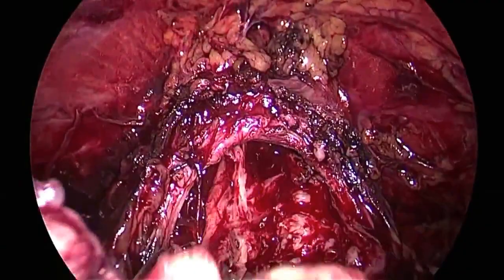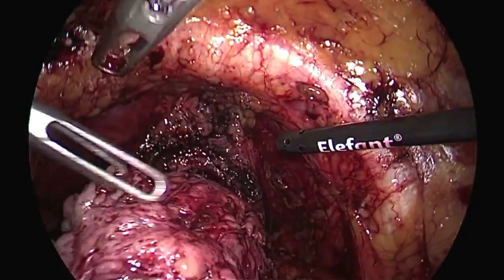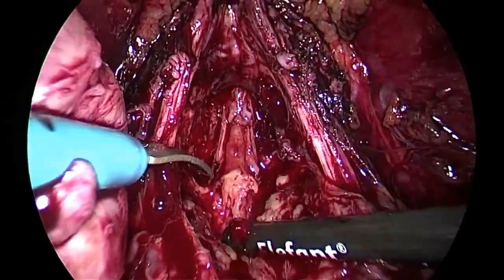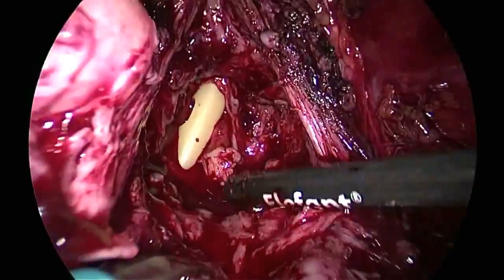Okay, I perform the enucleation. The 2 lobes are clear. And so this is the prostatic loggia. The urethra. Can you put the catheter inside, please? The Foley catheter, please. Okay, this is the veromontanum, and this is the prostatic loggia, and this is the bladder neck.